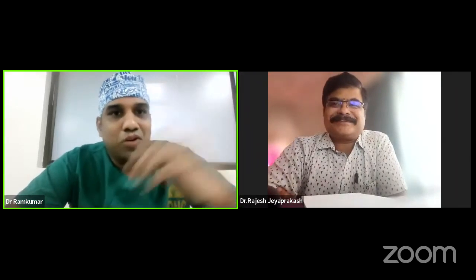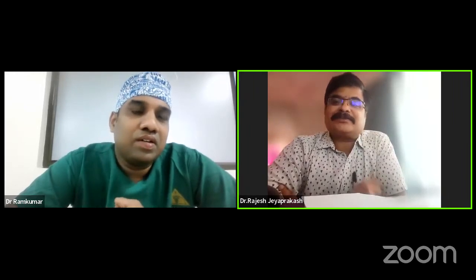Can we take this as, for postgraduate sake, maximum 4 hours? iGel, you can go with their recommendation, which is 4 hours. 4 hours, okay. As you quoted supraglottic airway devices for LSCS, which supraglottic airway device will be good as a rescue in LSCS? Sir, from the exam point of view, it's ProSeal.